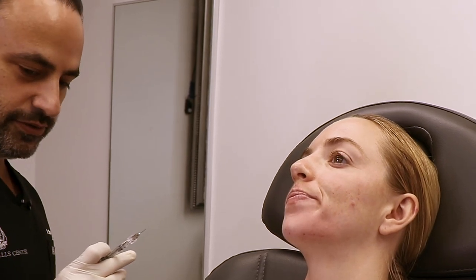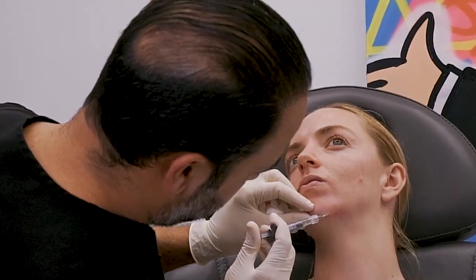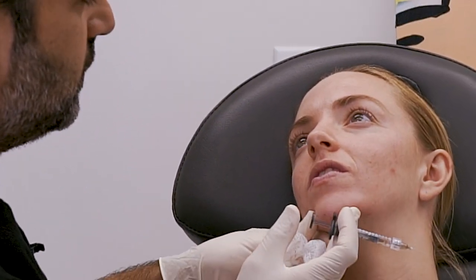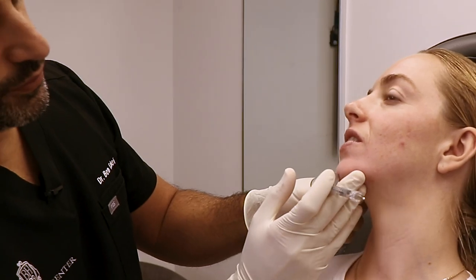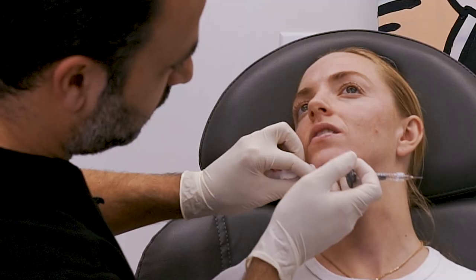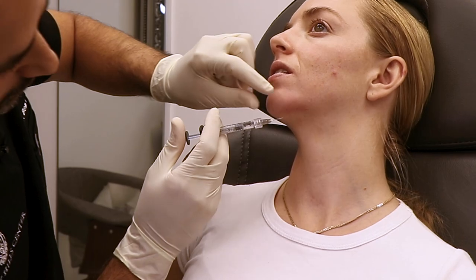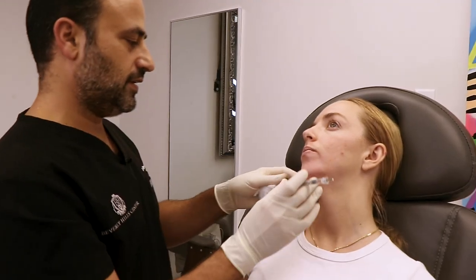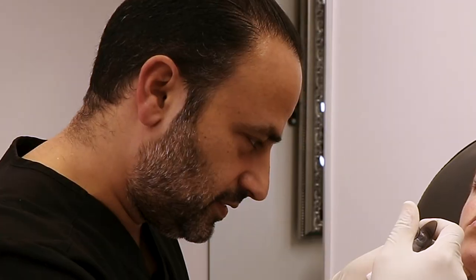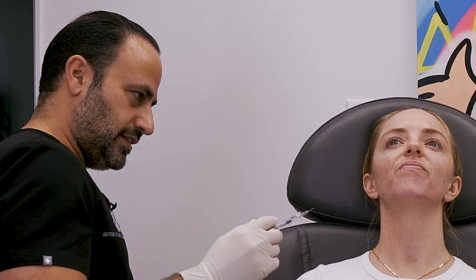When you do the chin, you want to have the patient a little bit lower sometimes so you can peek up and peek down. I don't like doing periosteal injections on the side because you can hit the vessels that come out and cause vascular compromise from the mental foramen — vessels from the neck and the facial artery that come up. This is a pretty risky area if you go deep; if you stay superficial, nothing happens. This side doesn't really need much. Remember, we are not symmetric animals.